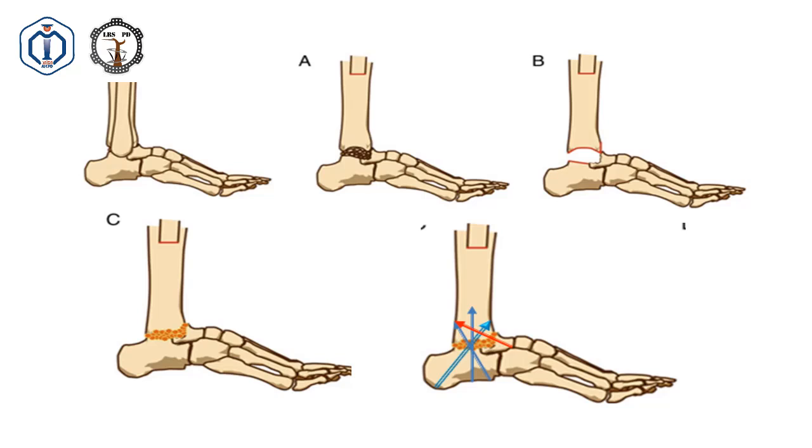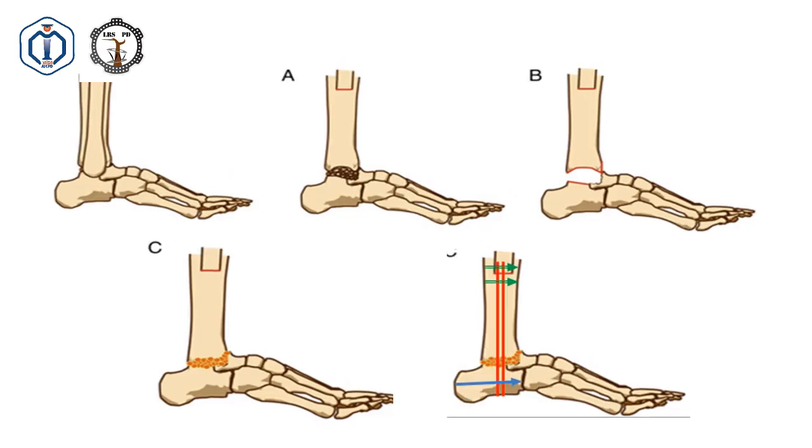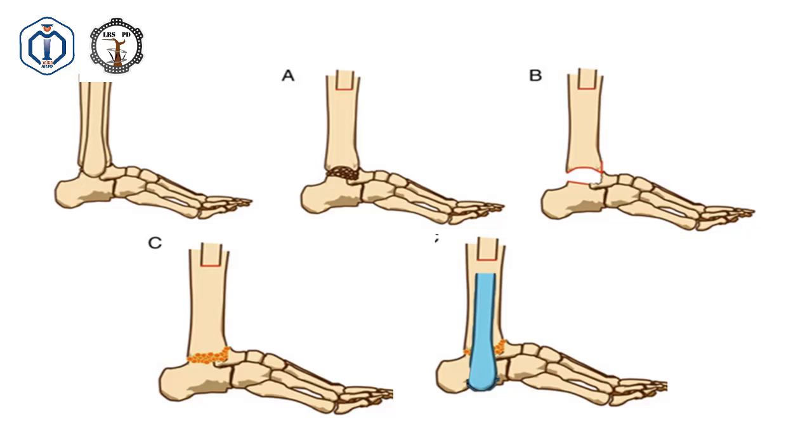And here by intramedullary nail and by retrograde fibula.